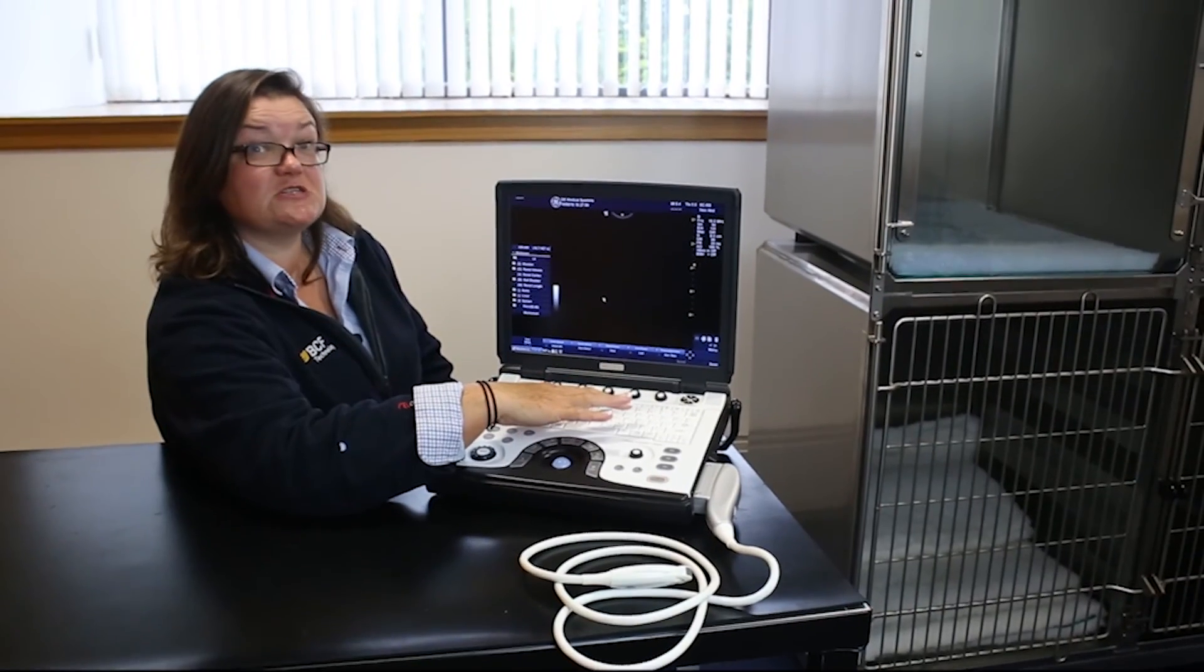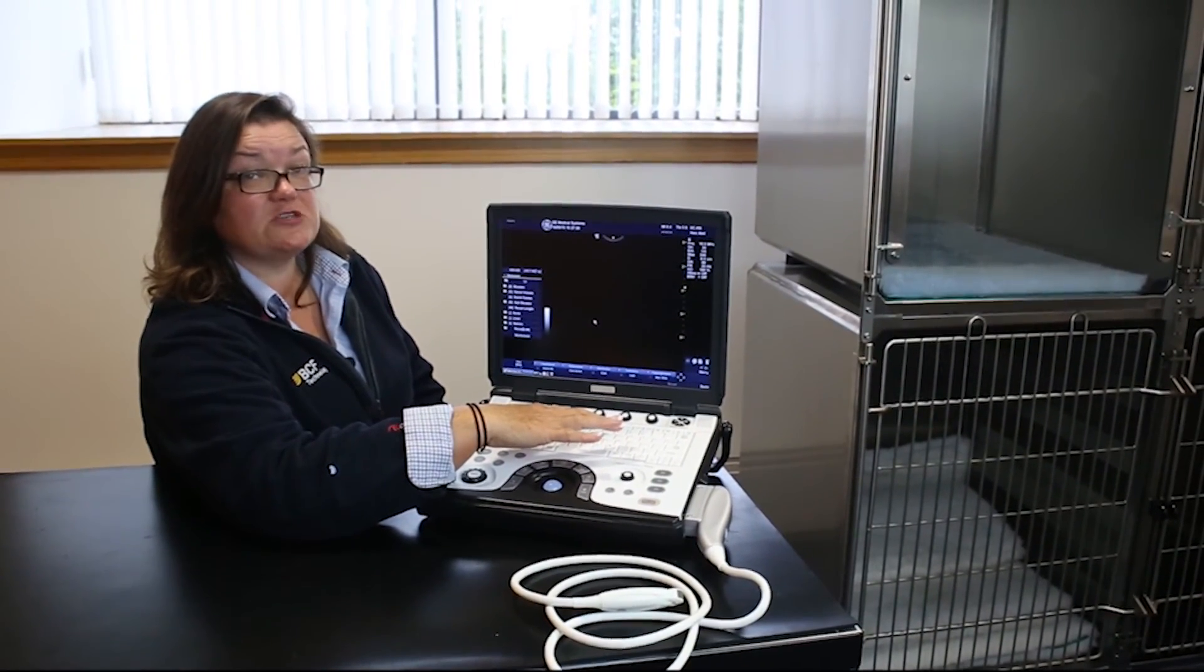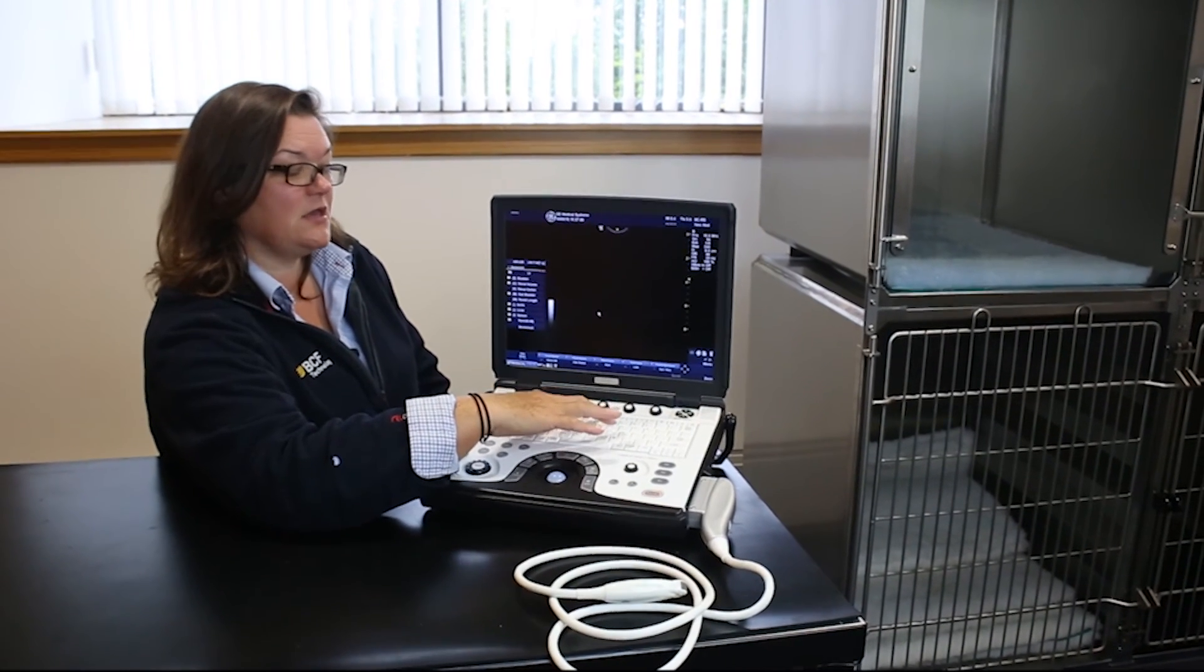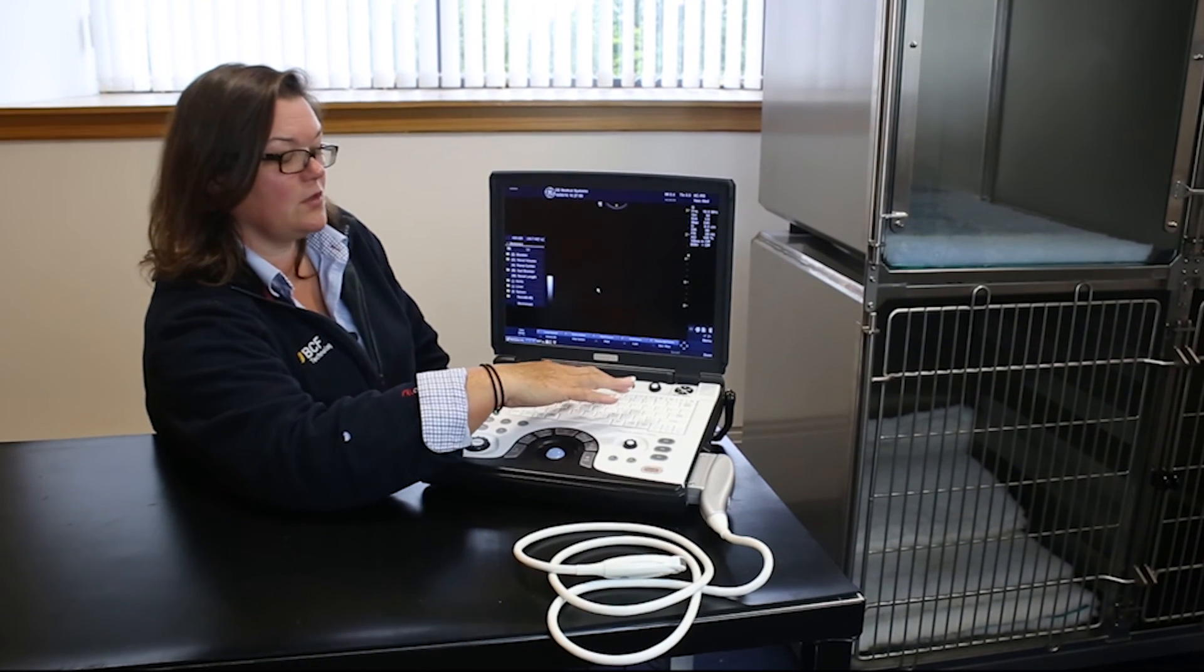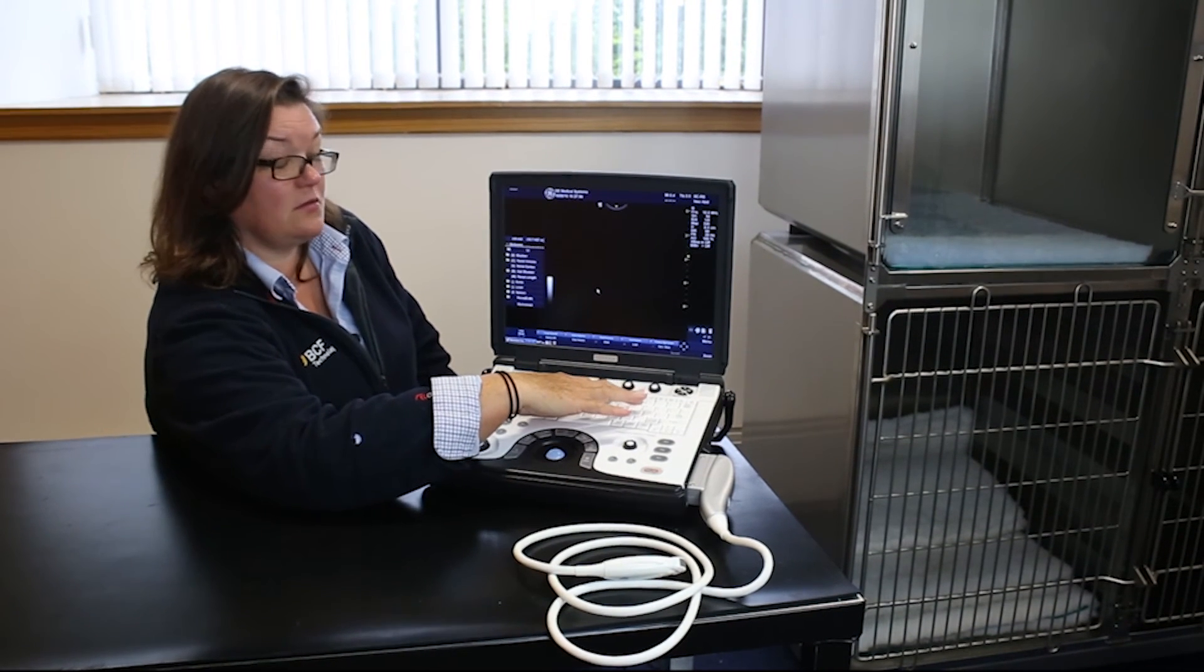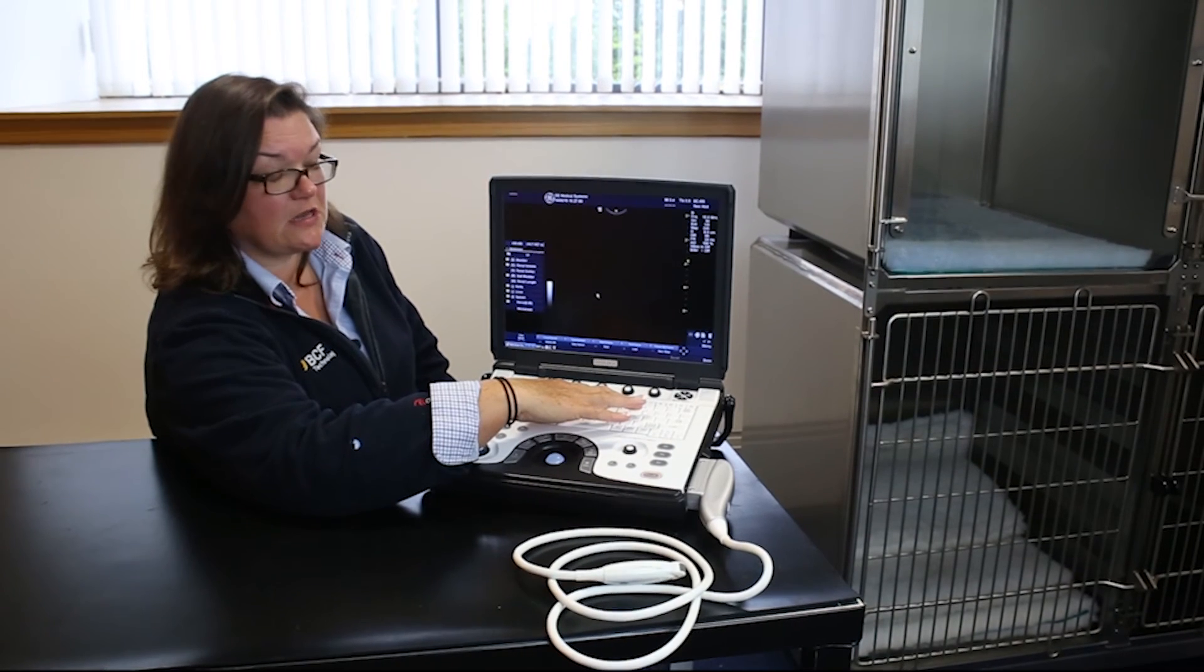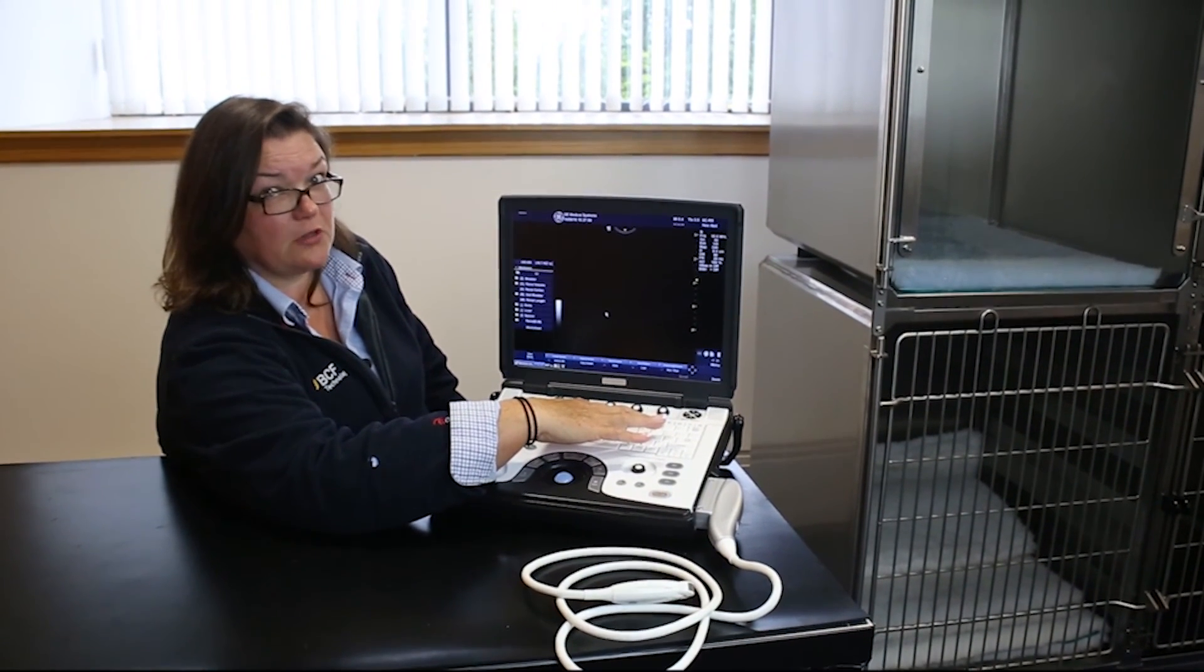The rest of the functions along the top will depend very much on what options you've taken and what's installed on your specific machine. It's possible to have 3D software, logic view, an ECG capability if you're doing cardiac scanning and also continuous wave Doppler.